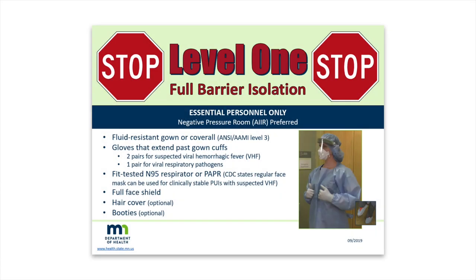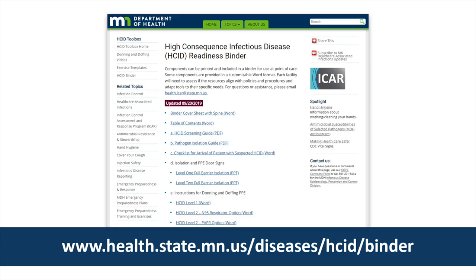This video shows how to don and doff personal protective equipment, or PPE, used for high-consequence infectious disease Level 1 full barrier isolation. These guidelines are adapted from CDC guidance. Please refer to the written step-by-step instructions for donning and doffing PPE in the HCID Readiness Binder for situations where Level 1 PPE is used and also for more detailed information.